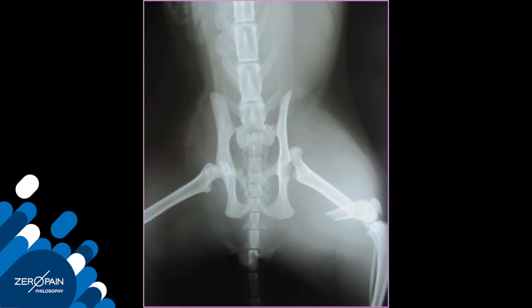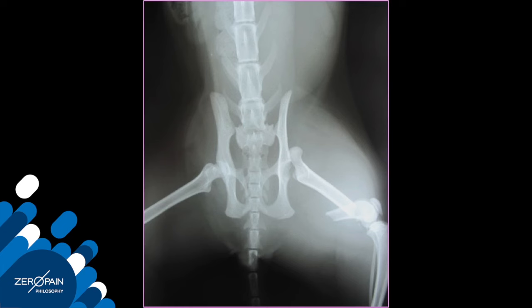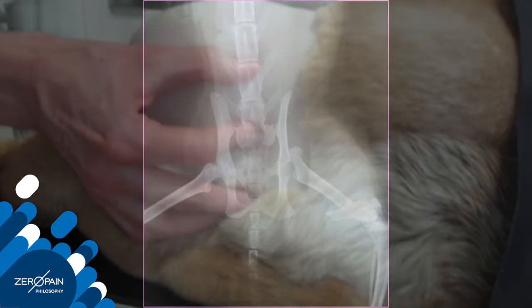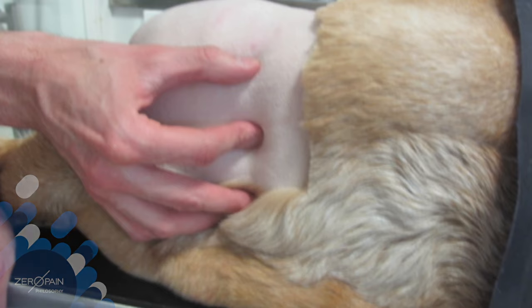In this cat with a sacroiliac luxation the landmarks are altered. In this obese dog palpation of landmarks is difficult.